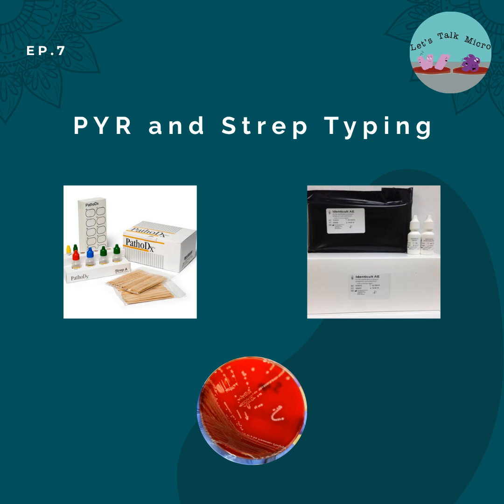If it's beta hemolytic, you can have Enterococcus or Streptococcus pyogenes. But Streptococcus pyogenes will type A, whereas your Enterococcus, when it's beta hemolytic and you do the typing, will be negative. And then you do your PYR. So if your PYR was positive, you do that. If your PYR was negative, then do your typing. And depending on what Lancefield result you get, those are your probabilities of the species.